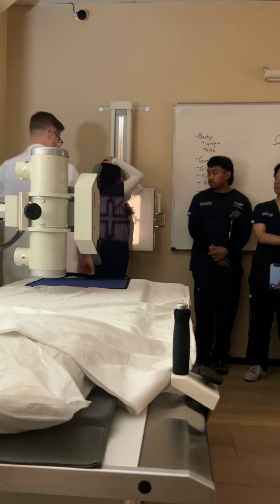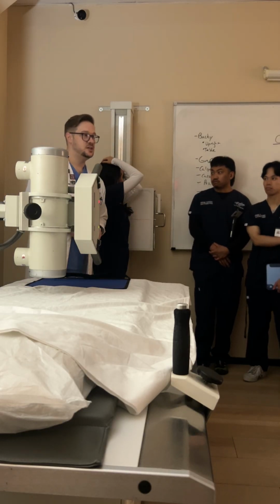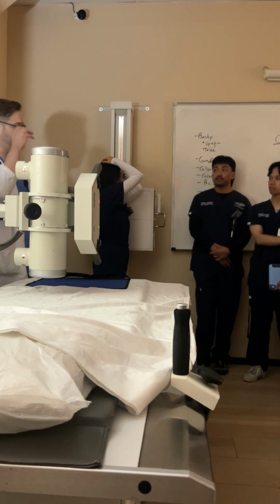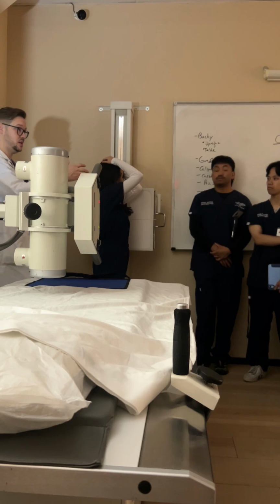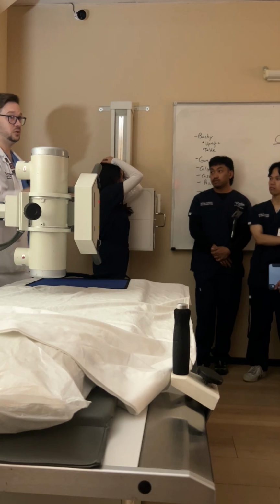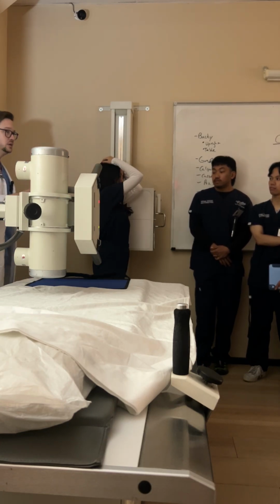Okay? And then find your T7 first, and then we're going to lower just a little bit beyond that. Not because of the position, but whenever you switch somebody from PA to lateral, we see more of the posterior dimension of the lungs. That costophrenic angle goes down much further. So it's not uncommon to have to go down a little further on a lateral.